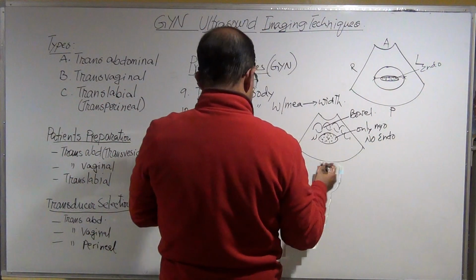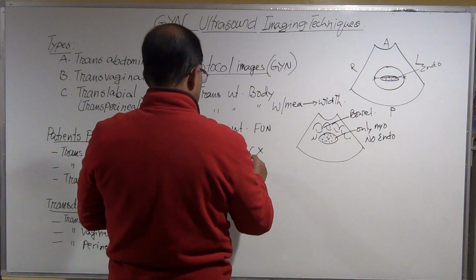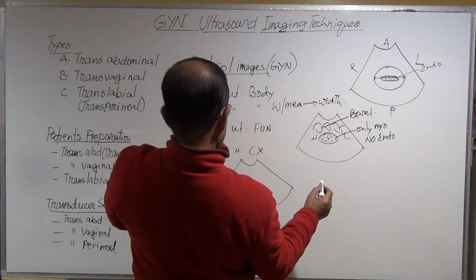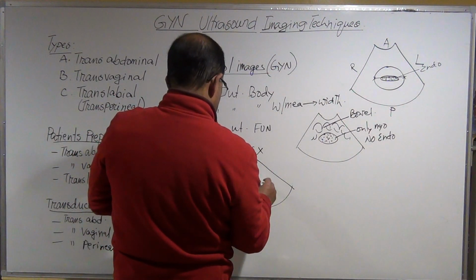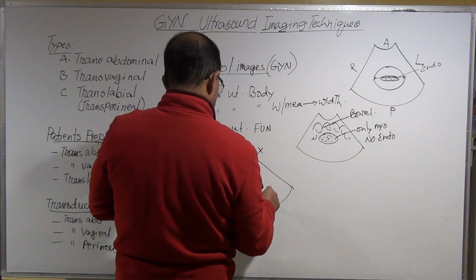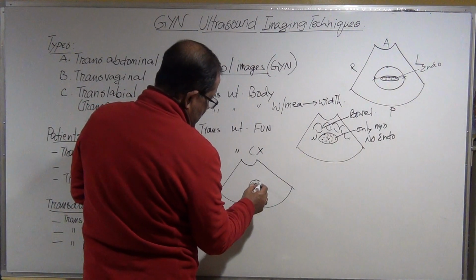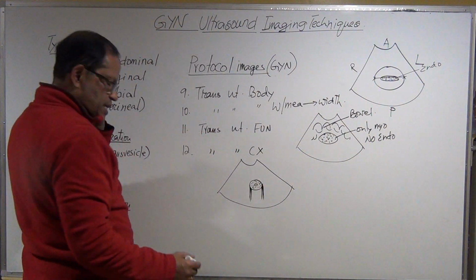For the cervix, I'm drawing it here. You'll see the cervix and cervical canal is shining, and you'll see the refracting shadow.